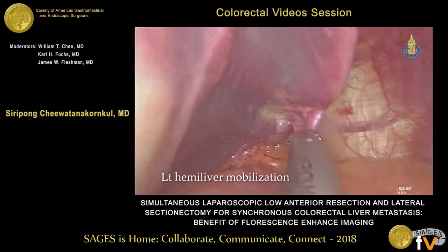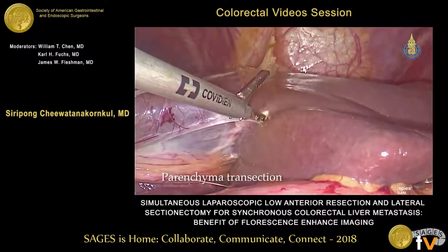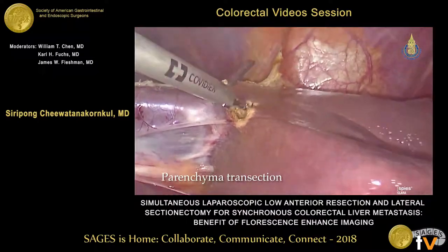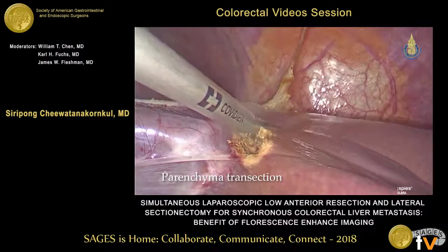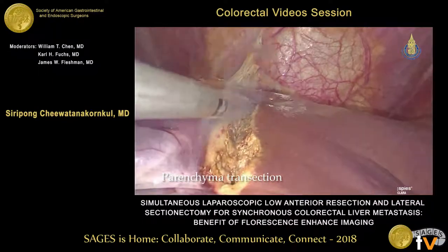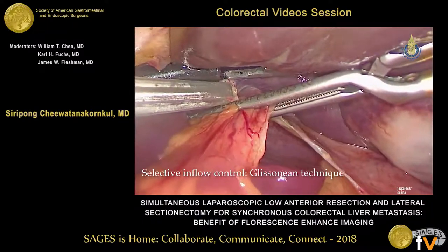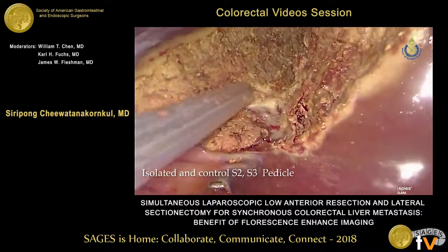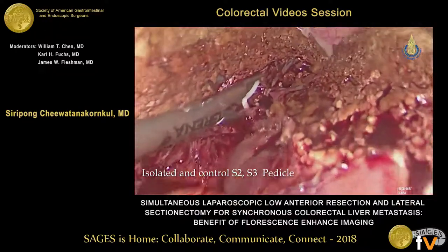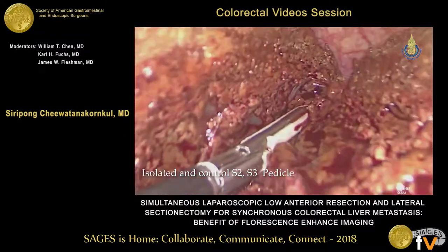You can see the tumor is quite big, but it is very mobile. We start by dividing the triangular ligament and then do the parenchymal transection. This operation is done by another team — my colleague performs it after my operation finishes. We do selective inflow control, and sometimes we use the device for dissecting the vascular pedicle. We then control the S2 and S3 pedicles with clips and divide them.